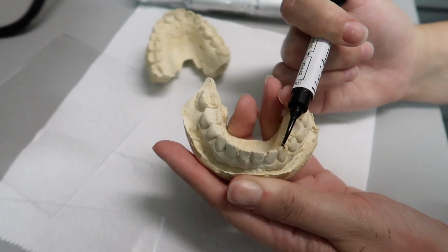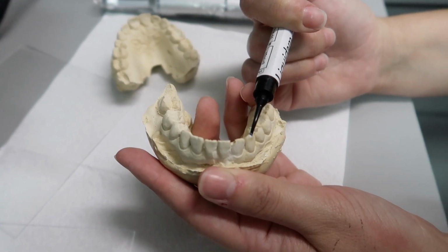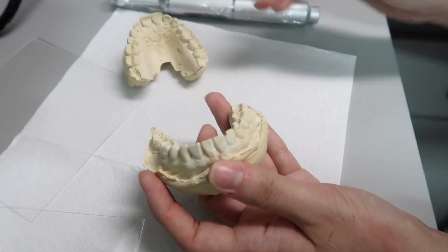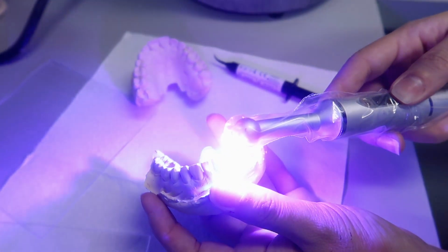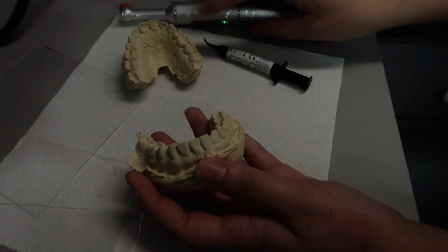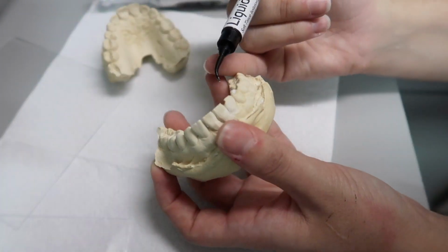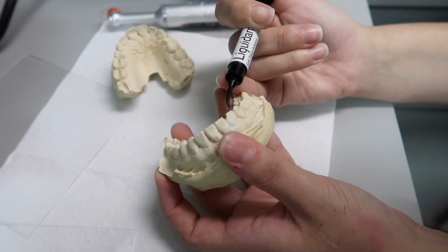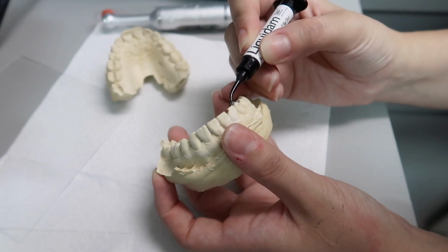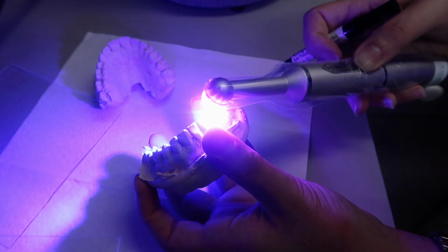So I'm gonna start with this one here, so I'm just gonna go ahead and fill in. These voids on the incisal are the worst. They really are. And so kind of like that. You are saying if you have it on the incisal, it's trickier because that's where it's gonna sit over. So if you don't do it right, overfill it or something, or it's a different shape than what the tooth actually is, right, it won't sit. Tray won't sit. It won't sit properly.